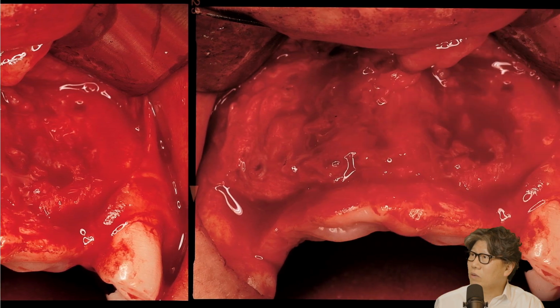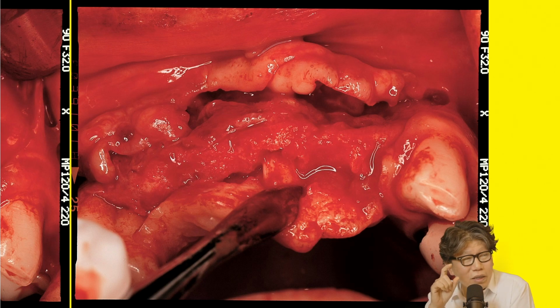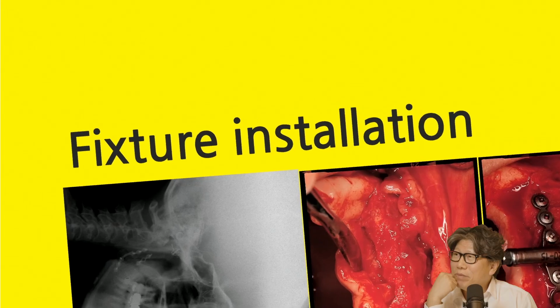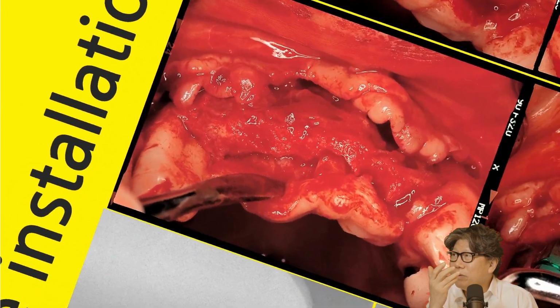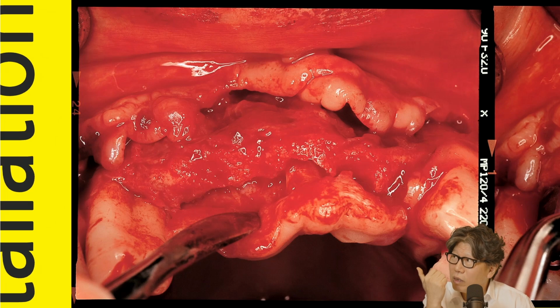So I removed it, and then if you look at it now, what was a little bit of a weakness, the alveolar bone thickness, doesn't change. It doesn't increase. It just increases in length. That's all I could do then, and that's all I can do now. I've done quite a few. I think I've done a few.